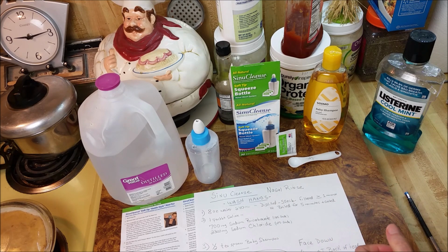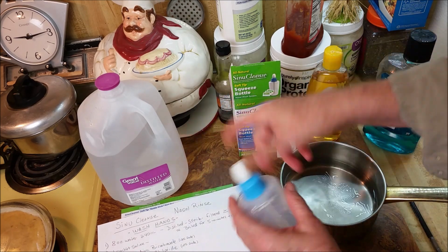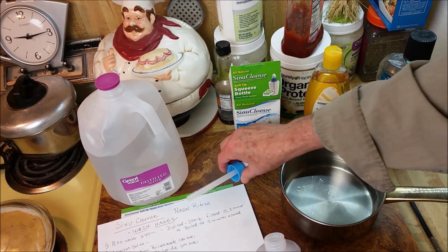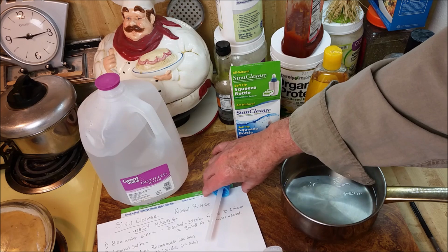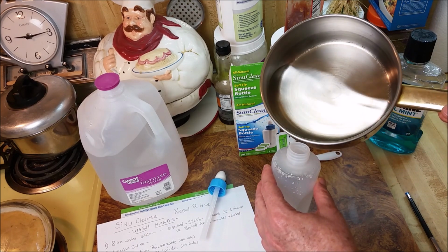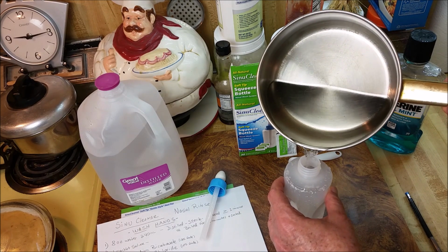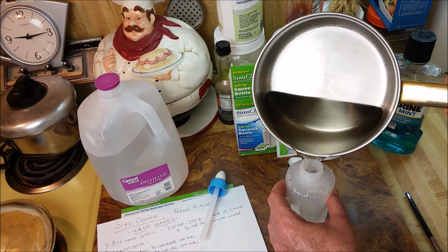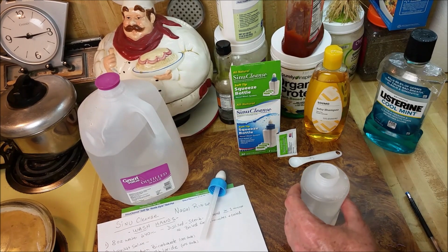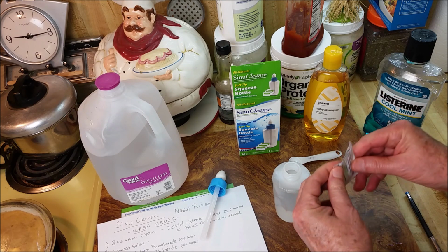Now let's go ahead and show you how quickly we can make the solution. This is water that's been boiled and it's cooled. My hands are clean, and okay, don't want to touch anything there. We're going to be using 1 packet. Now, the literature says you can use 2 packets if you like, but they recommend you start with 1. You want to see how well you respond to the saline.